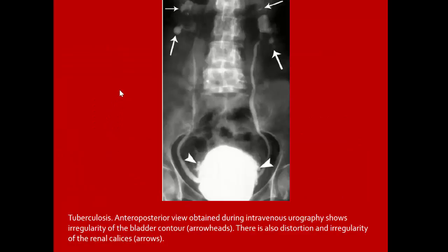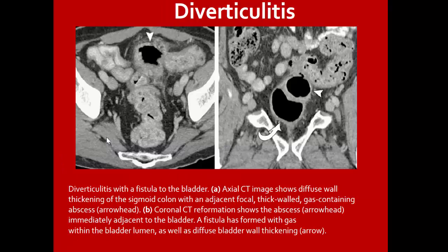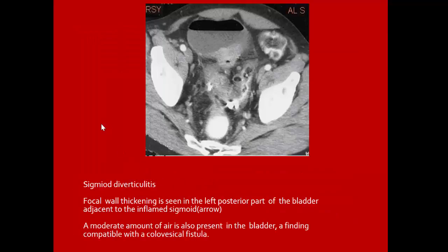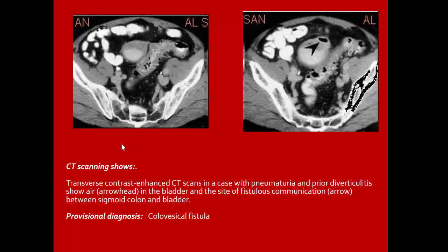TB IVP radiograph shows irregularity of the bladder with distortion and irregularity of the renal calyces. Diverticulitis with fistula to the bladder: also one cause of gas in the bladder and cystitis. CT shows diffuse wall thickening of sigmoid colon with adjacent focal thick-walled gas-containing abscess, coronal CT shows abscess immediately adjacent to the bladder, fistula forming with gas within the bladder lumen, sigmoid diverticulitis with focal thickening of the thin posterior part of the bladder adjacent to inflamed sigmoid, moderate amount of air present in the bladder compatible with colovesical fistula.